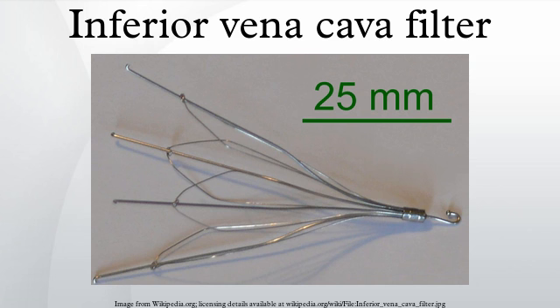9% delayed filter penetration of the IVC greater than 3 mm, parts of filter broke off in 2%, caval filter migrated to heart or pulmonary artery. Numerous small published articles and case studies report similar issues to the above. Most notably, filter fracture, broken struts migrate to retroperitoneum, requiring exploration. Perforation into the duodenum, resulting in severe diarrhea and weight loss. Arterial hemorrhage, requires surgery to avoid death.